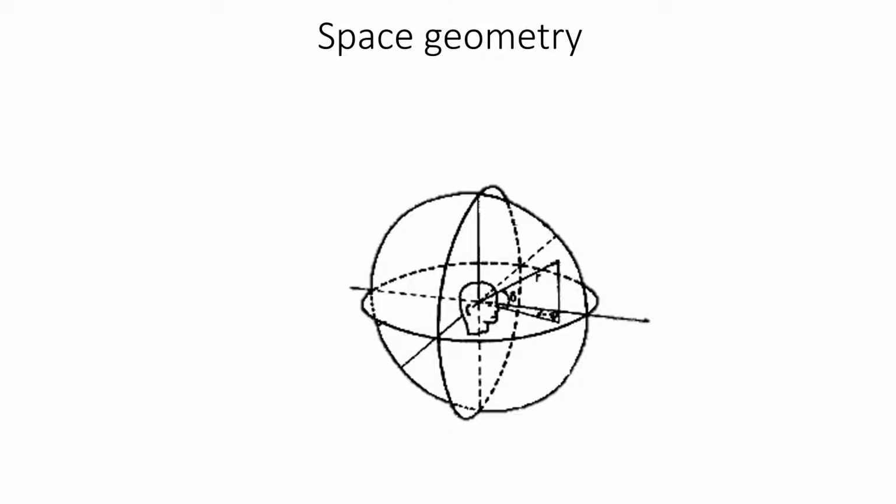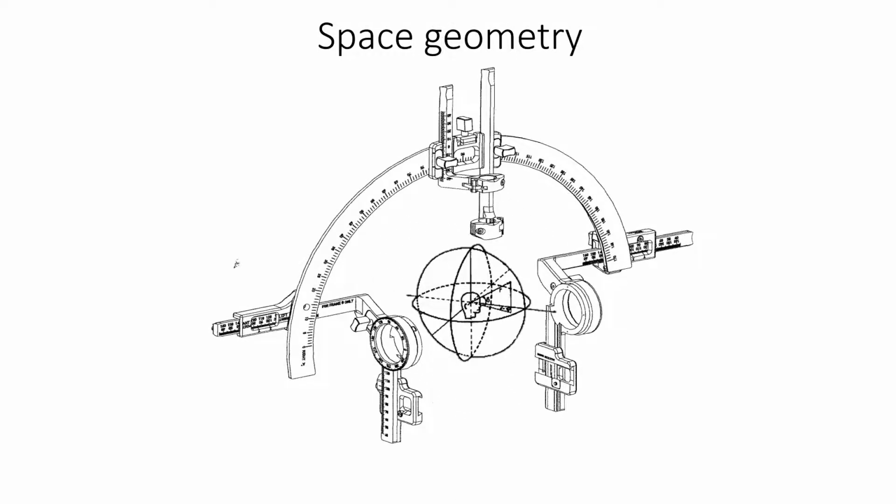So, let's start by looking at how DBS is done and how it works. DBS is a stereotactic neurosurgical procedure, and stereotactic is basically space geometry. It is a method to identify any point in the brain with the mathematical coordinates of a 3-dimensional coordinate system. It is also the name of the technique which we are using in order to reach the deep structures of the brain based on these coordinates.